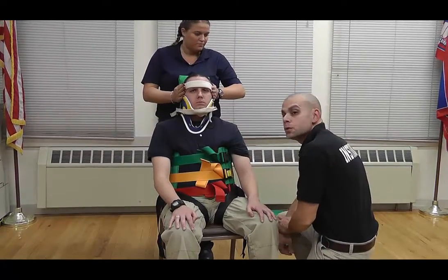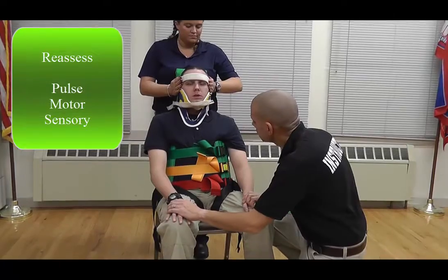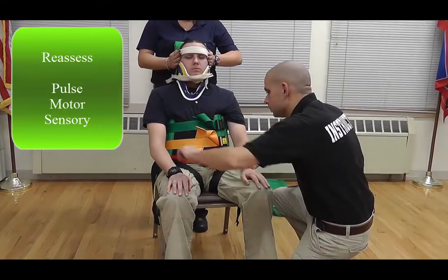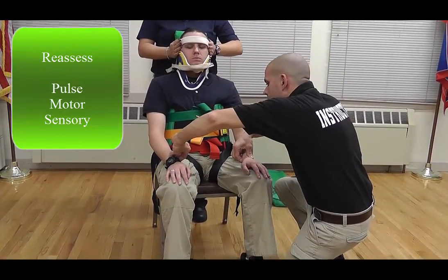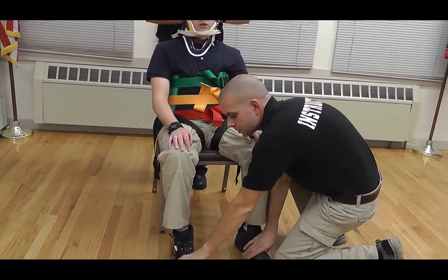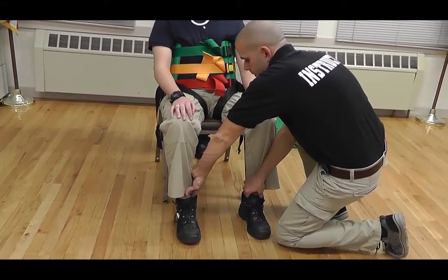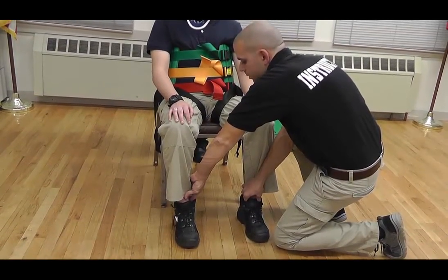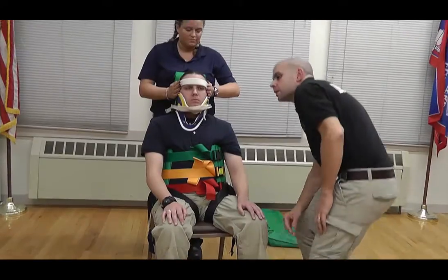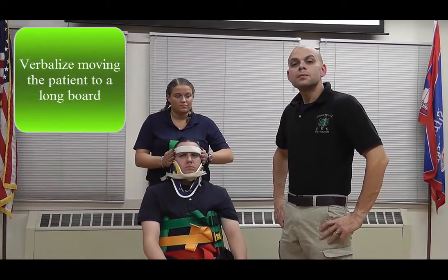Now I'm going to check all my straps to make sure that they are the appropriate tightness. Next I'm going to reassess pulse, motor, and sensory in all four extremities. Chris, do you feel me touching your hands? Yes. Wiggle your fingers. Pulses are present. Chris, do you feel me touching your toes? Yes. Wiggle your toes for me. Pulses are present. And finally, I would verbalize moving the patient to a longboard for transport. And I'm done with the station.